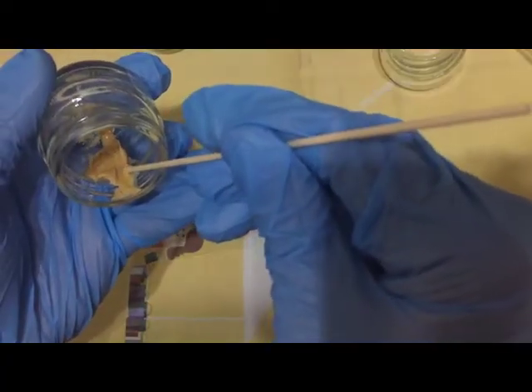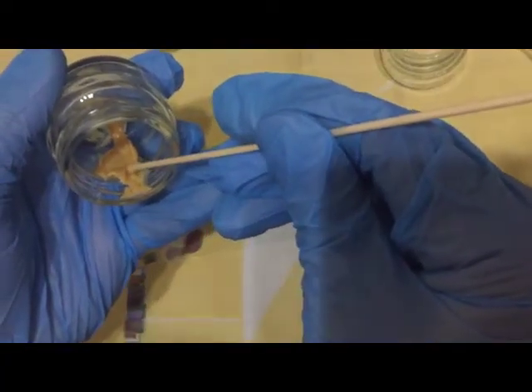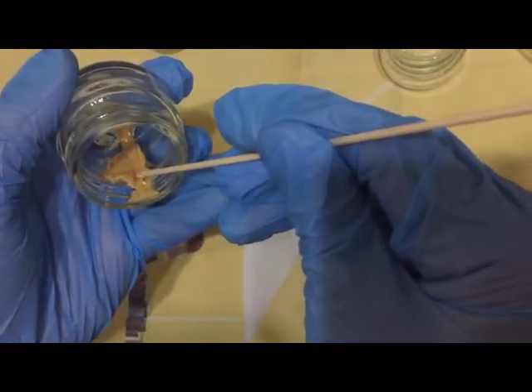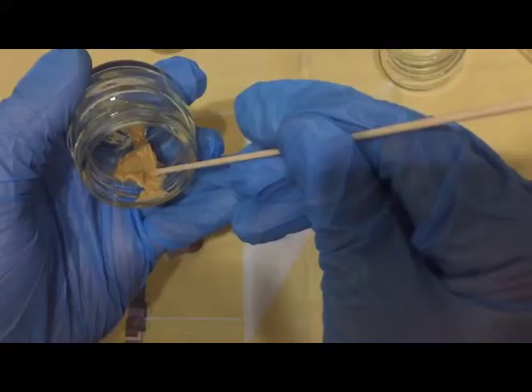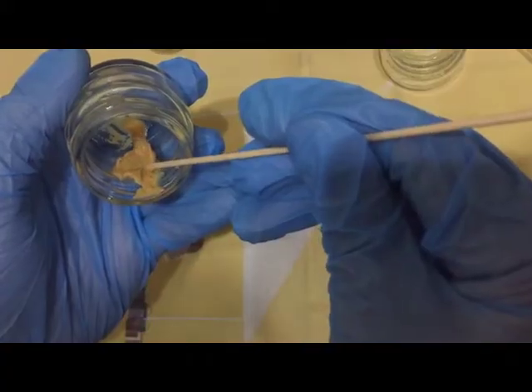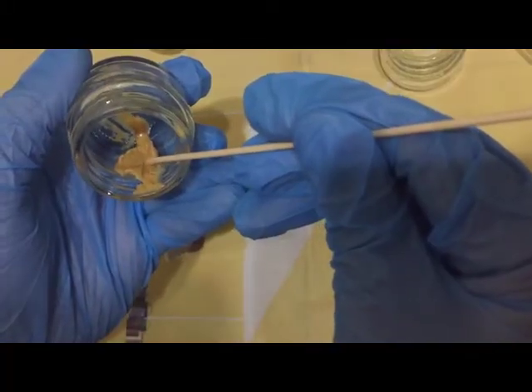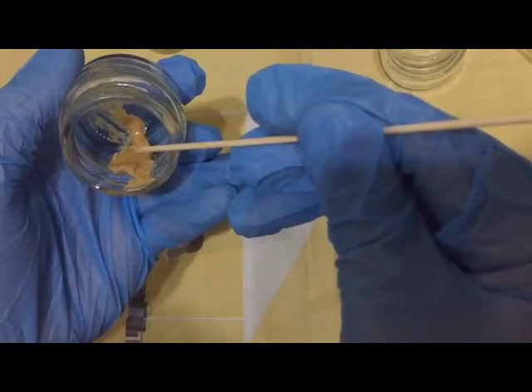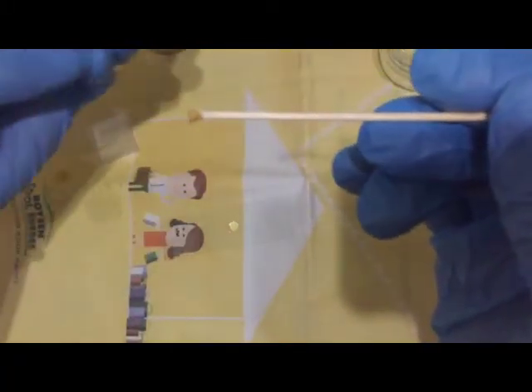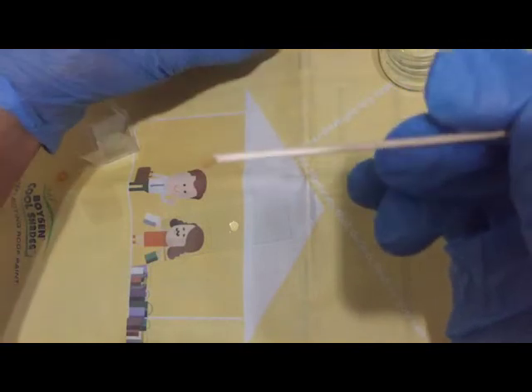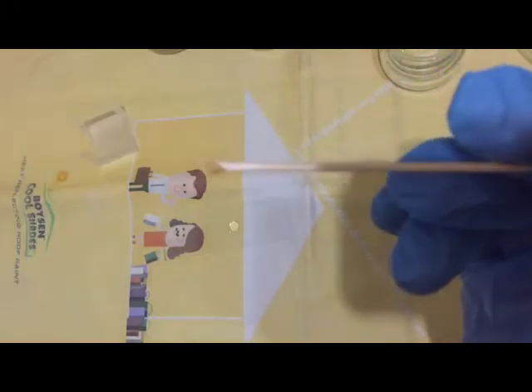So you just get from the best portion of your stool sample and just get a very small amount which would fit the tip of your applicator stick.